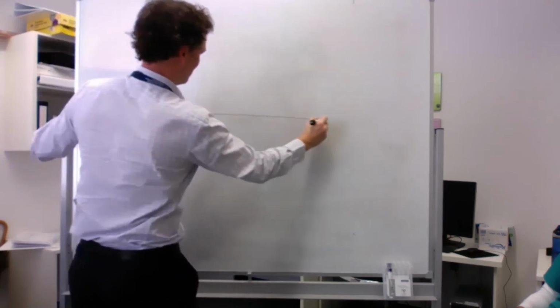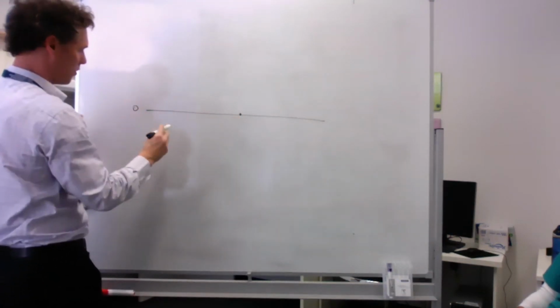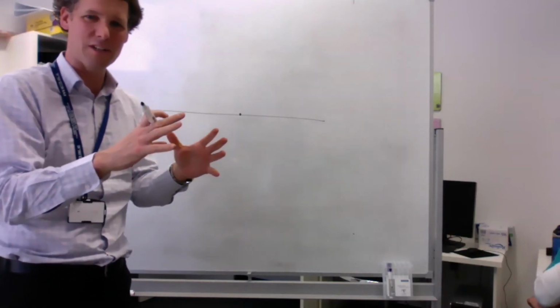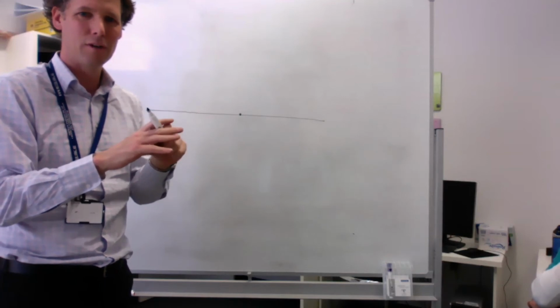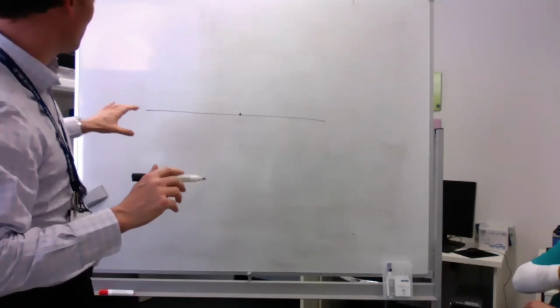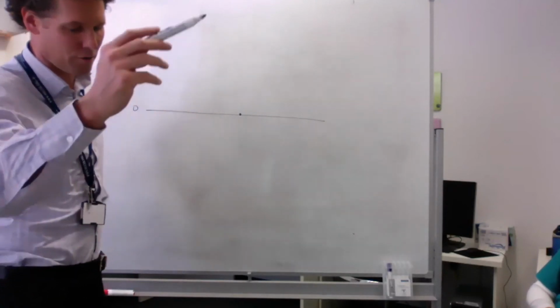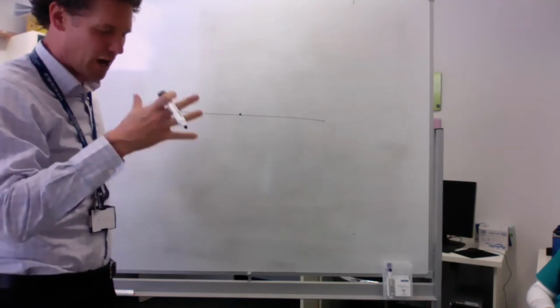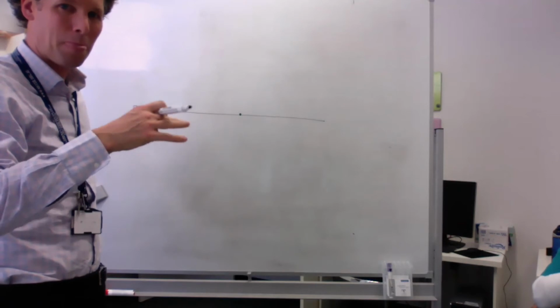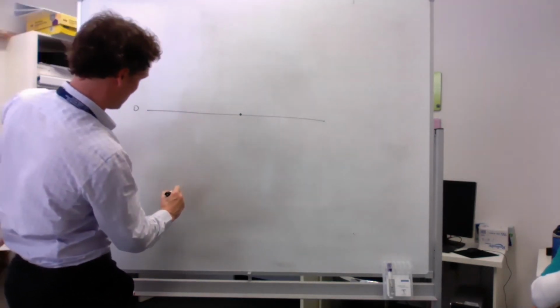So that was the 2D assessment. How about I just draw it? Did you get the image that I sent you of the mitral valve? Picture, yeah. So what leaflets are we affecting? What I was hoping is you could draw the 4-chamber, 2-chamber, and 3-chamber, and what valves we're going to be affected with each.